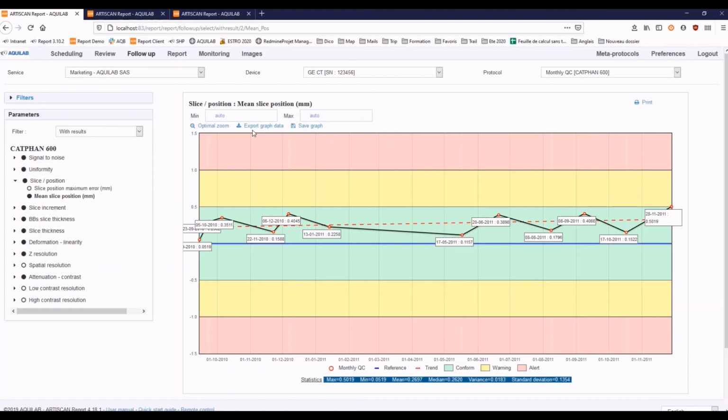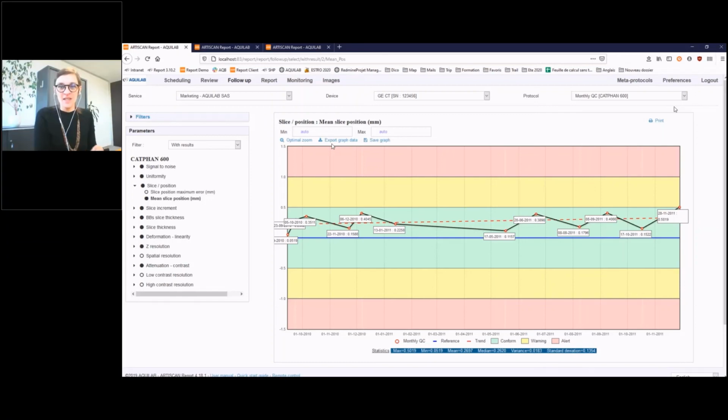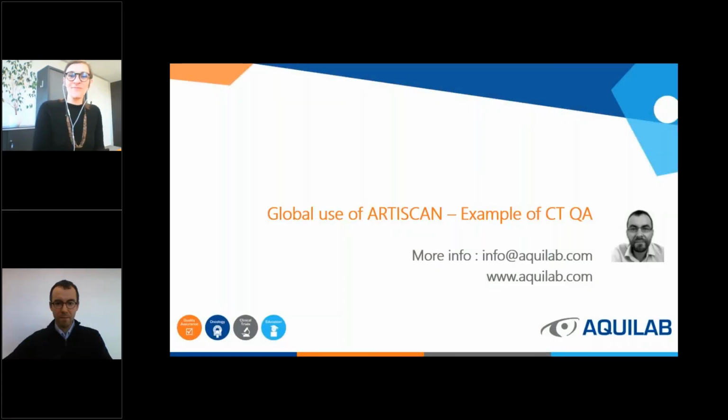Okay, thank you, Sylvain. So we get back with our webcams, and I will share my screen again. There we go. And we had a question from one of the attendees that is, how do you store the data? Is there a database?